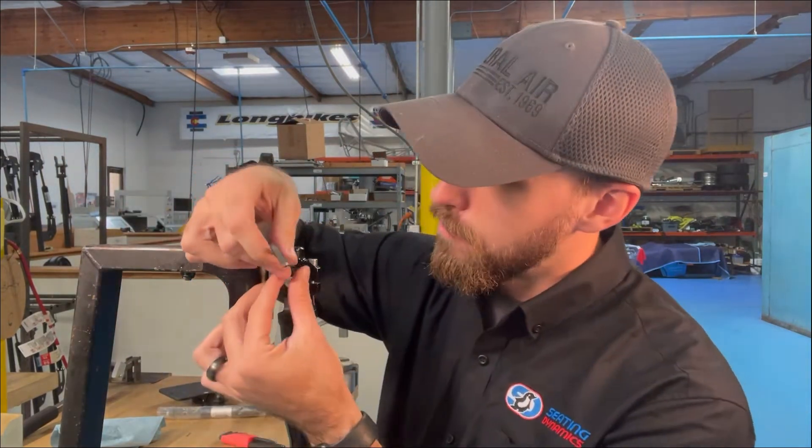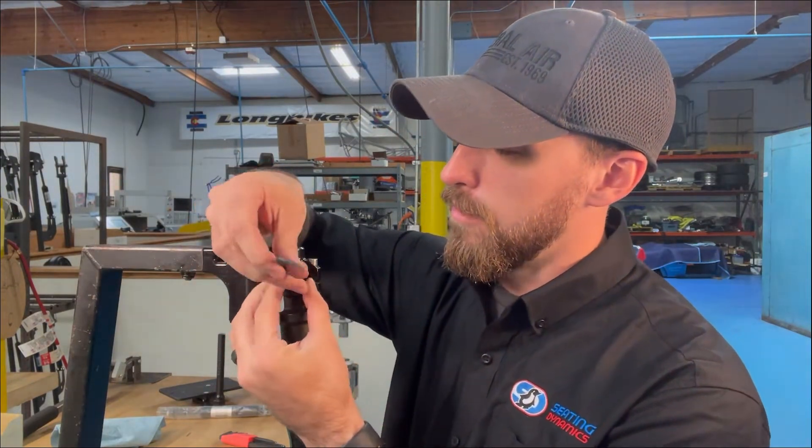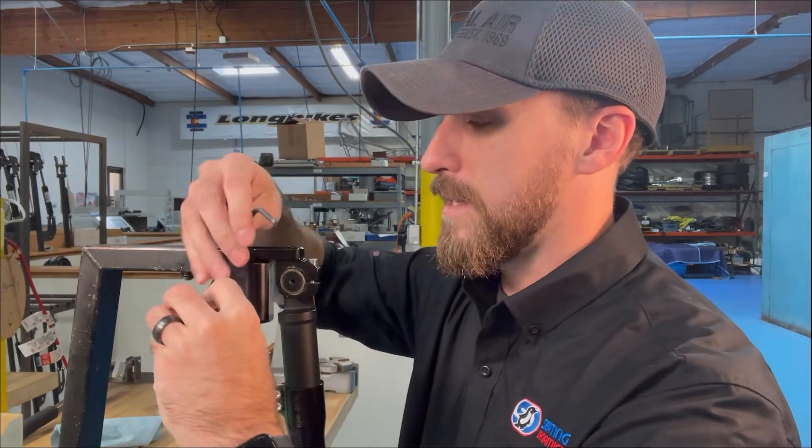To start, you're going to get your four millimeter allen key and remove this screw which holds the dust cover — take it all the way out and hold that dust cover so it doesn't skitter away underneath the couch or somewhere else.